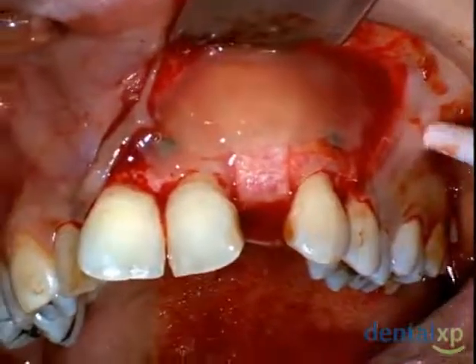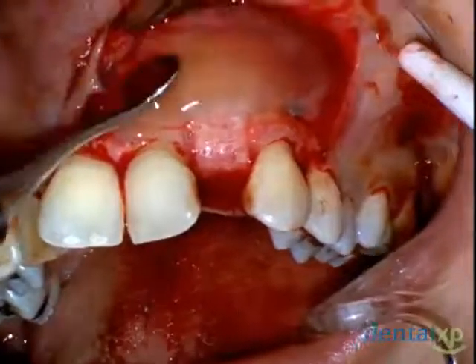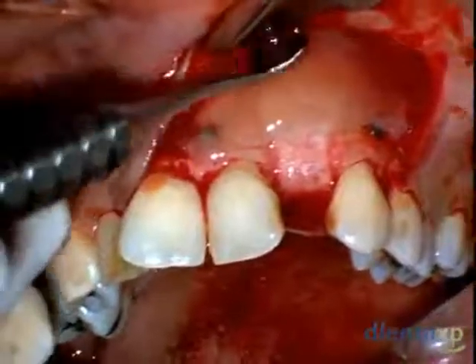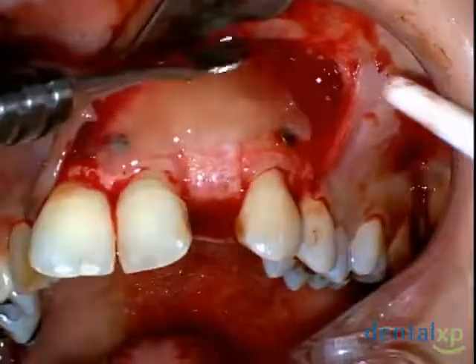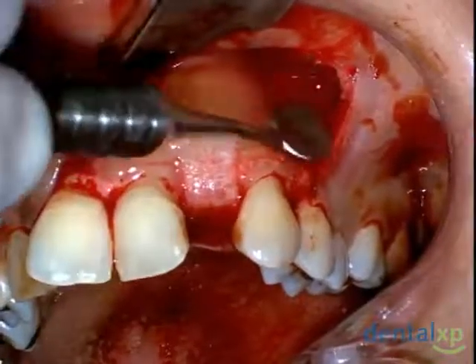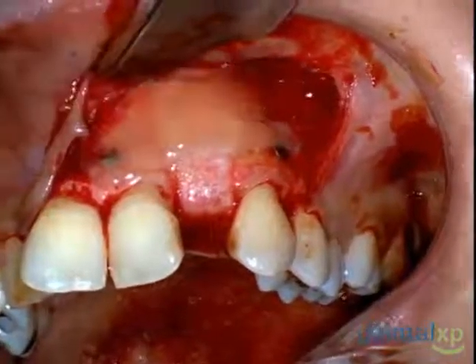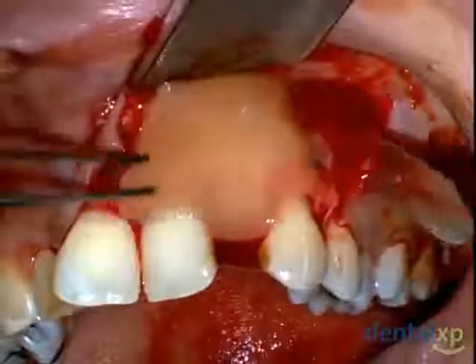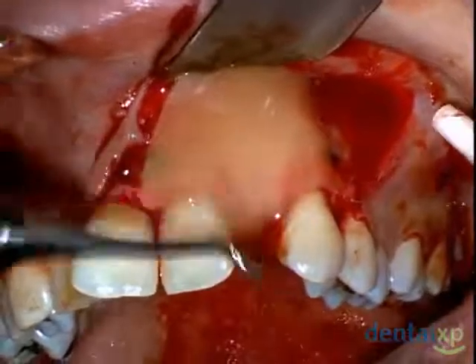So when we have large defects like this, I prefer to also utilize a collagen barrier in addition to the fibrin. This is just my preference, only because I realize that the extent of the defect will require a longer term barrier function to protect the bone and to make sure that the selected cells are allowed to populate the area, letting the osteoblasts have access to the area without having to beat the connective tissue and epithelium to that area. Once again, because we have layers of fibrin to utilize, I now place the fibrin membrane over the collagen, again, in a layered approach.